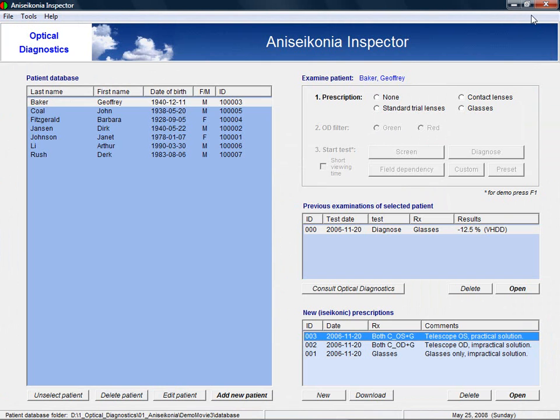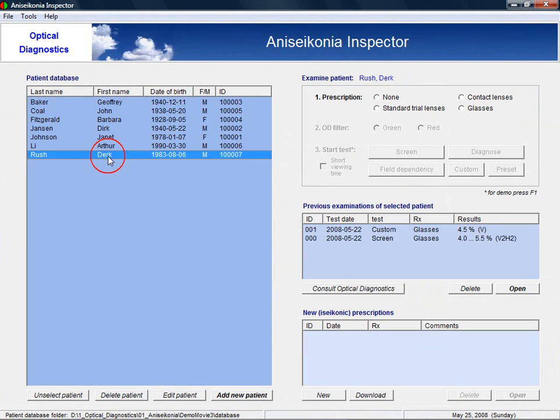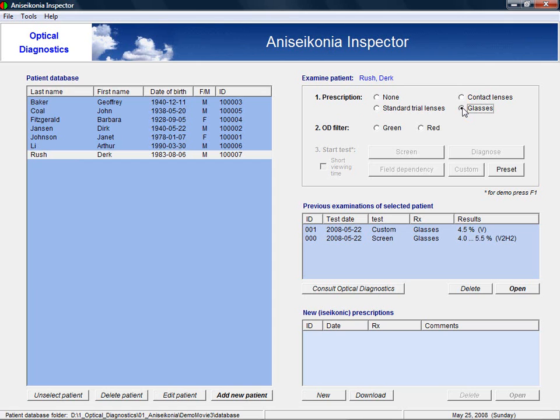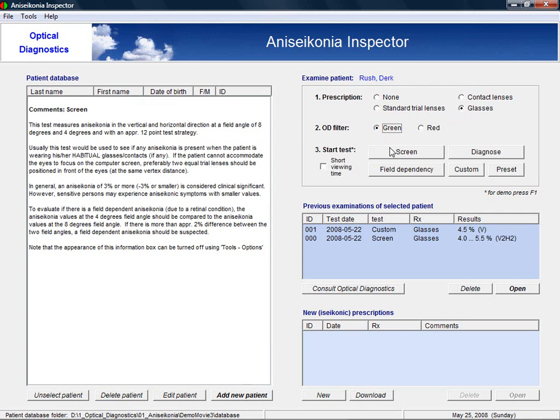To test the patient for aniseikonia, we first need to select the patient in the database. Next, you select the type of prescription the patient will be wearing during the test. And you will select which color of the red-green glasses will be in front of the right eye. There are different test programs and you will get additional information about these programs when you move the mouse on top of the different buttons.